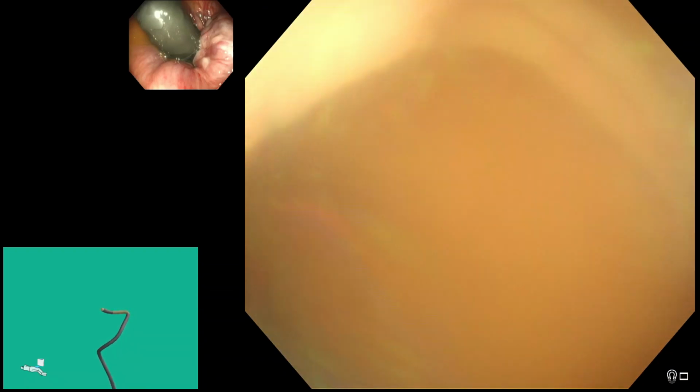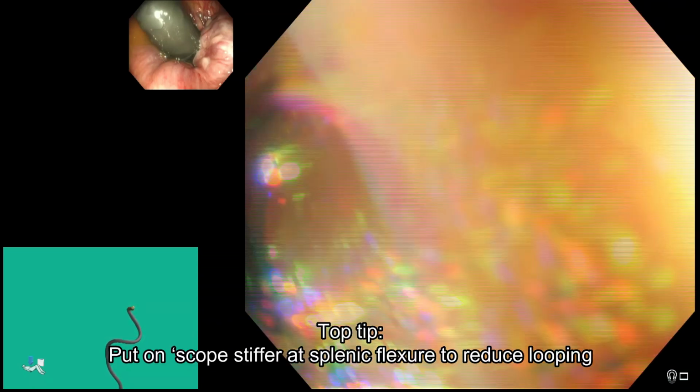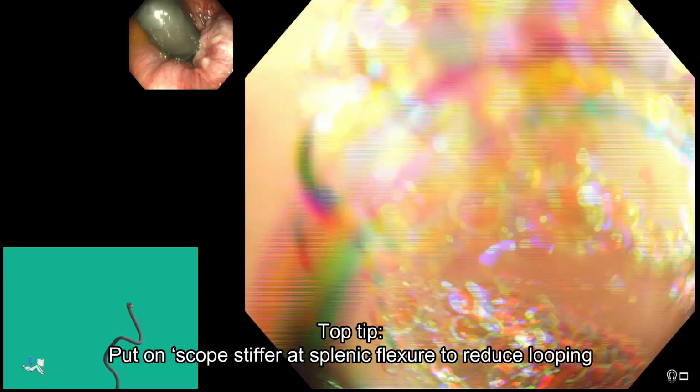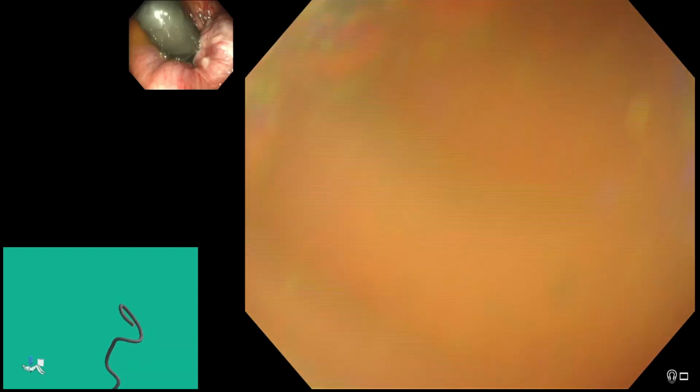Now, whether you carry on using water is pretty much up to you, because of course we've done all the hard work now. In terms of insertion, generally if you're using a scope with a stiffener, I put it on now, or if you're using a Pentax scope, you try and keep clockwise torque on just to keep the proximal shaft, which is in the sigmoid, straight.